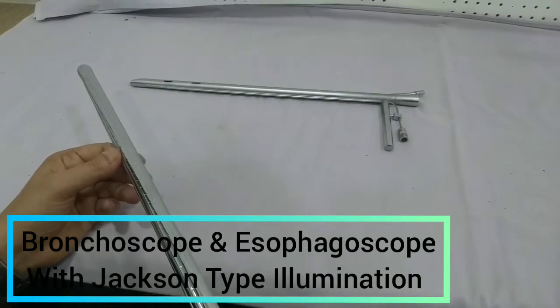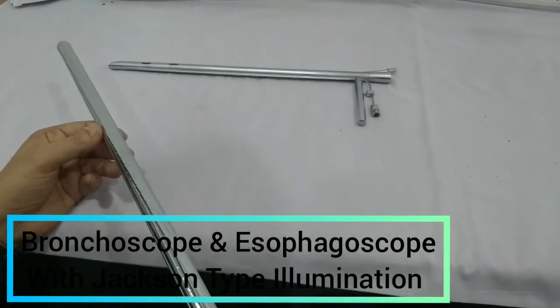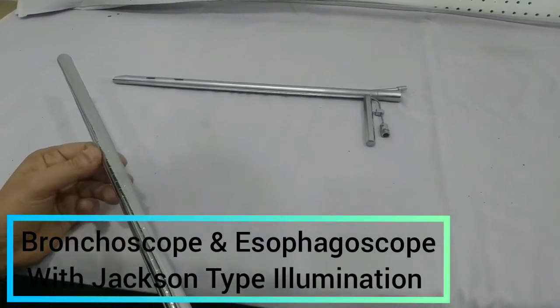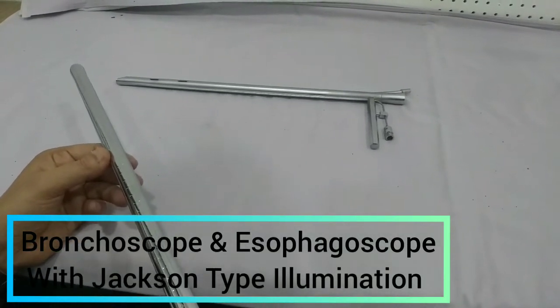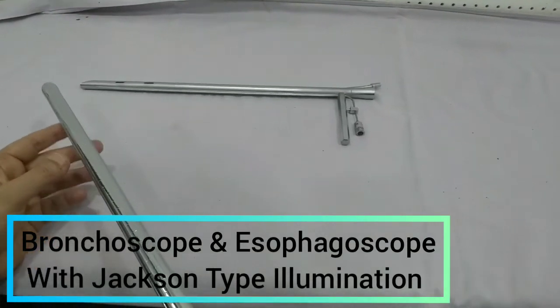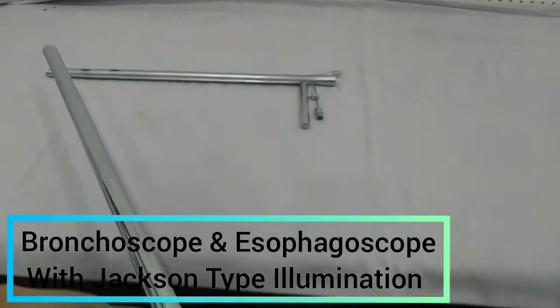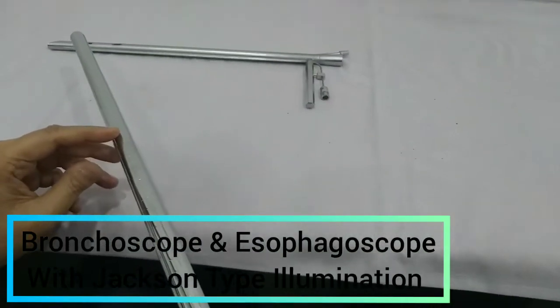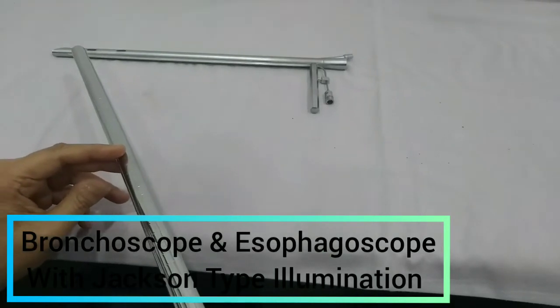At 22 to 25 cm we will encounter another constriction, and that is due to the left bronchus and the arch of the aorta. The last and lowermost narrowest part is the esophageal end, which comes at around 40 cm from the upper central incisors. Through this we can measure and know the depth of a lesion.